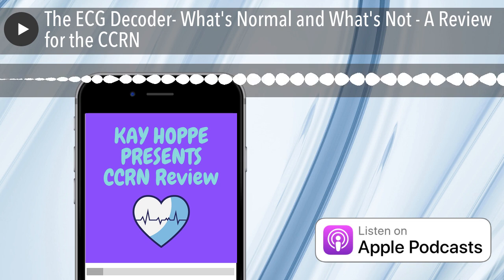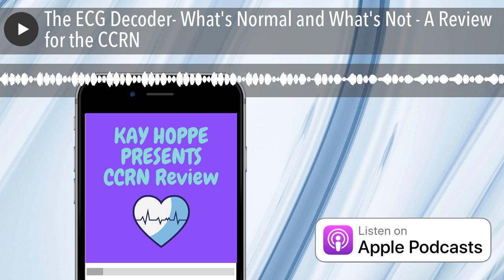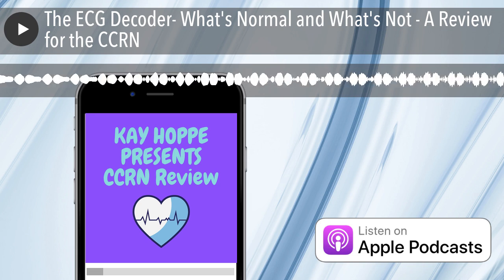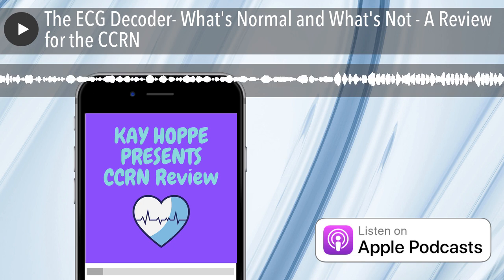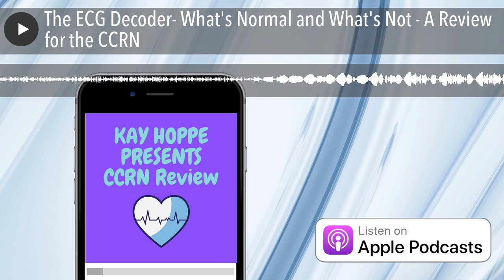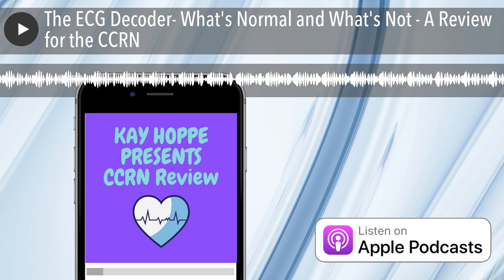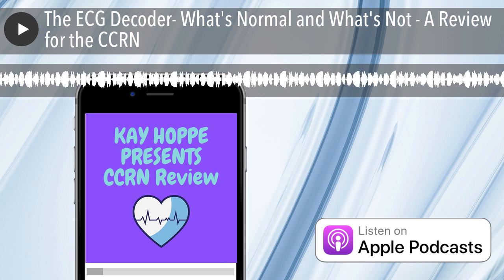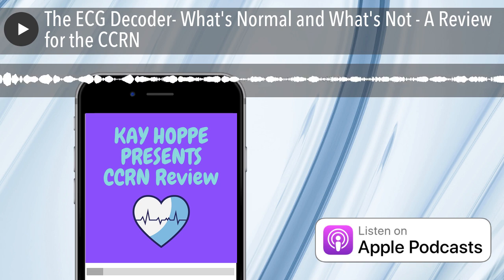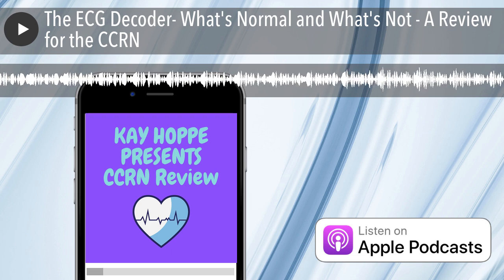So moving forward then, we go to the R wave. The R wave is always a positive wave. Sometimes we have two of them standing side by side. And a lot of times we call that a rabbit ear shape, where it's an RSR prime configuration. And the second R wave is always called an R prime wave. The S wave is always negatively deflected, and it's kind of the terminal negative deflection of the QRS.